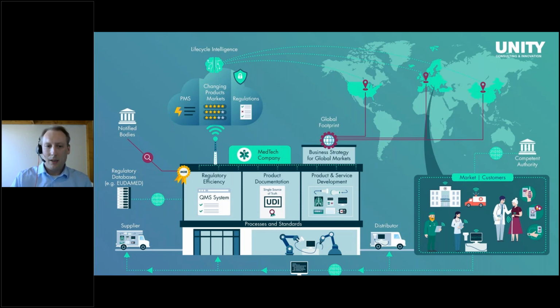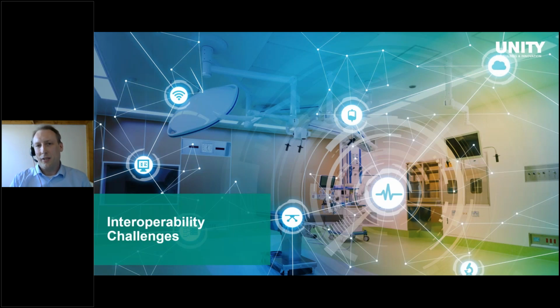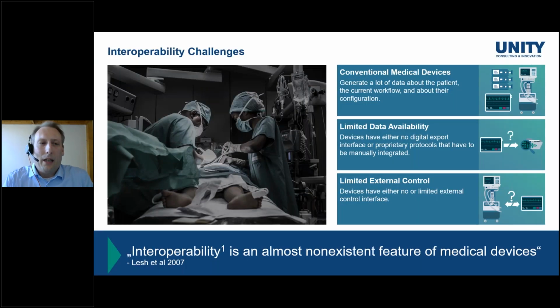I would like to start now with the interoperability challenges. I would like to depict what I see as the interoperability challenges based on a typical clinical scene. But maybe before we start, I should explain what I understand as interoperability. For that, I looked into the introduction of the FDA interoperability guidance. There's a statement that says, medical device interoperability is the ability to safely, securely, and effectively exchange and use information among one or more devices, products, and technologies or systems. That means that there are two parts to the definition of interoperability: the ability to exchange information and the ability to use this information that has been exchanged.